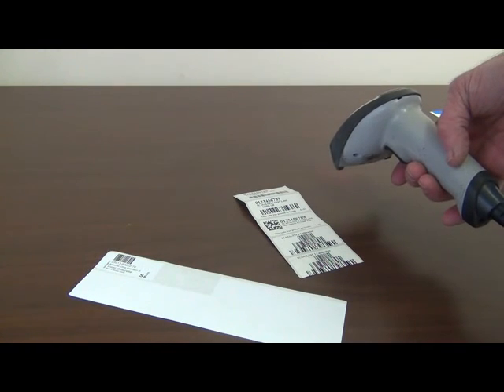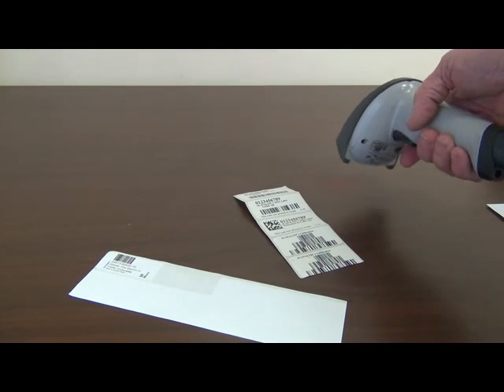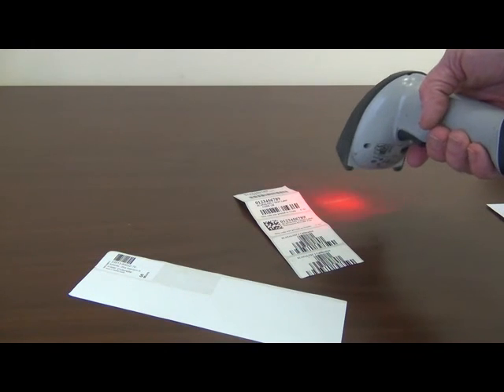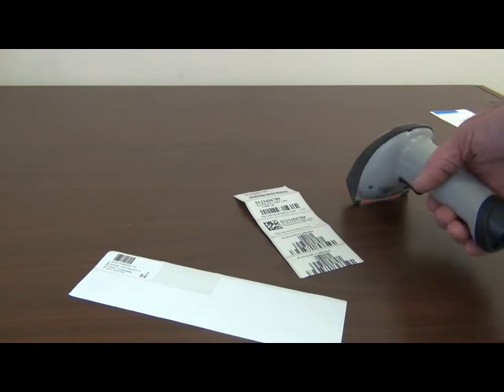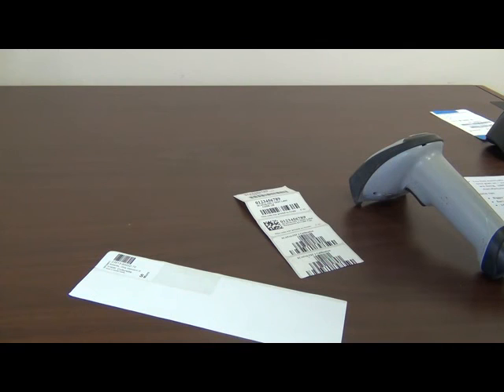The more you have left on, the more work the algorithms have to do to find the decoding algorithm for, in this case, 128, or in that case, Data Matrix. So you can improve performance of the scanners by turning off the symbologies that you don't want. And that also makes it easier for the IT guys to maintain an inventory of scanners that perform at a high level.